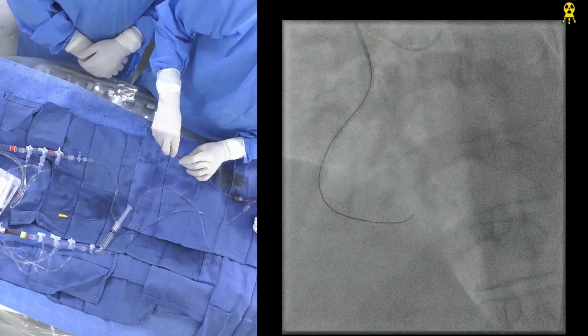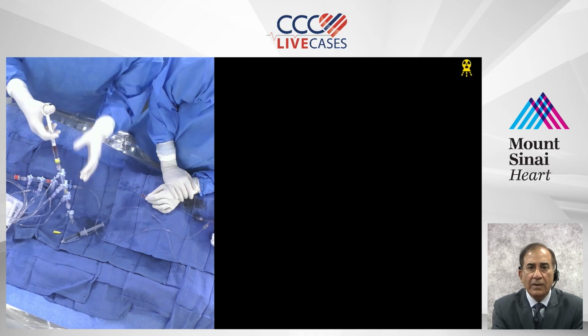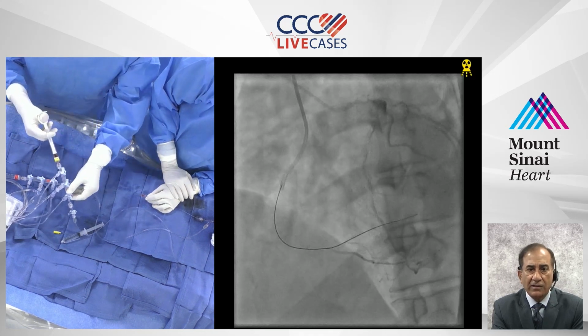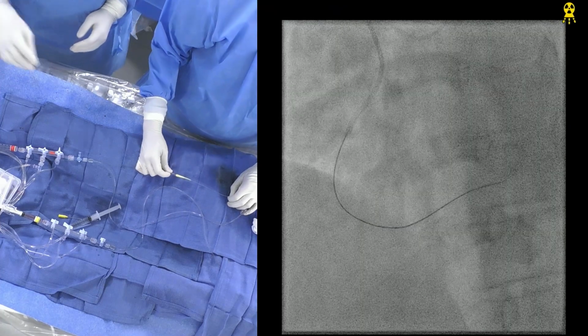You anticipated the two questions that came. Okay, there we go. Let's see where we are. Just the way it went, it all looks very good. Yeah, exchange length.